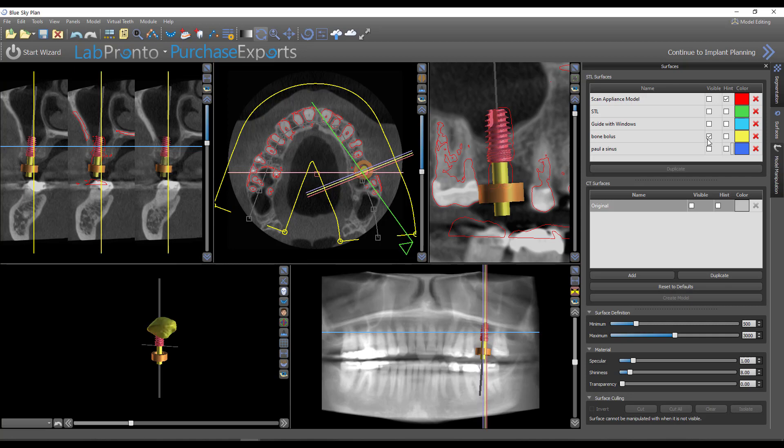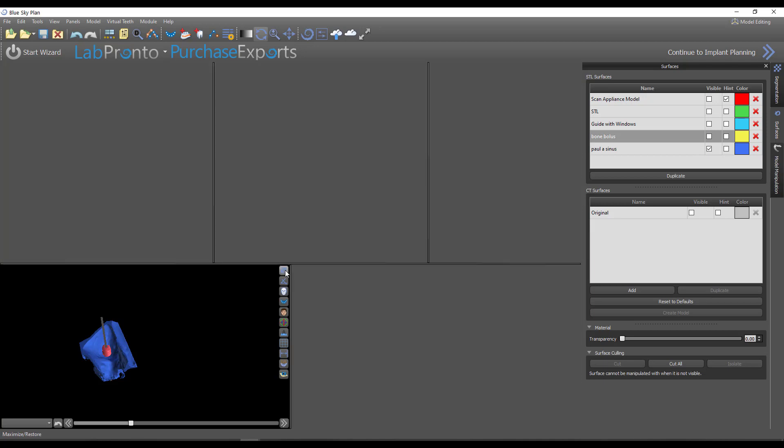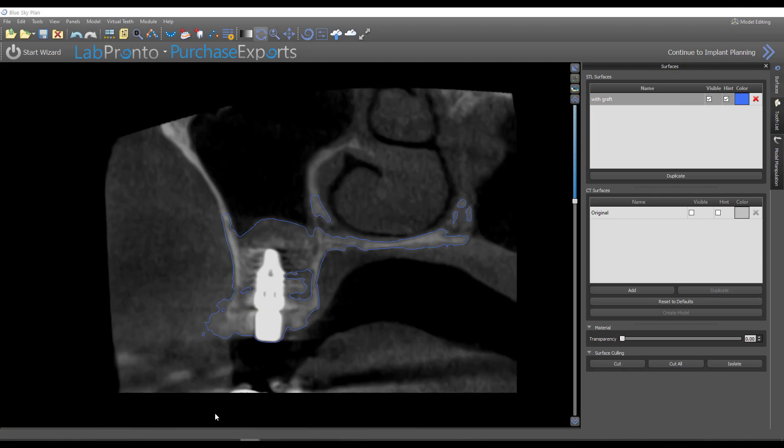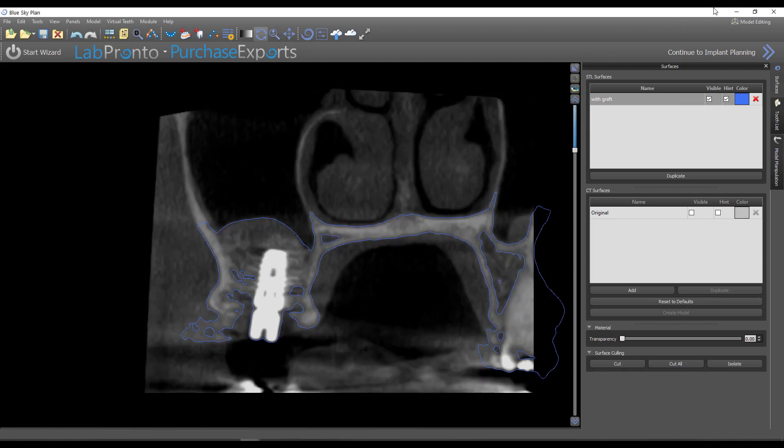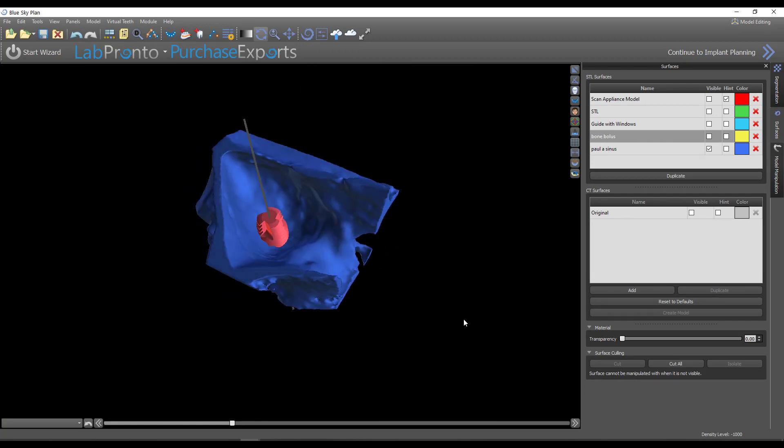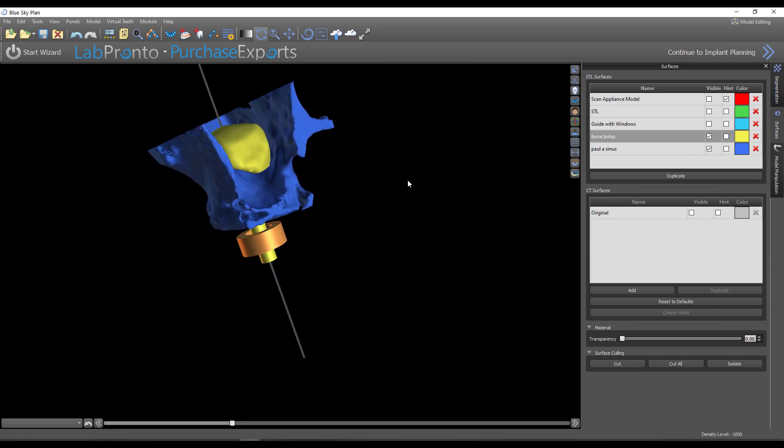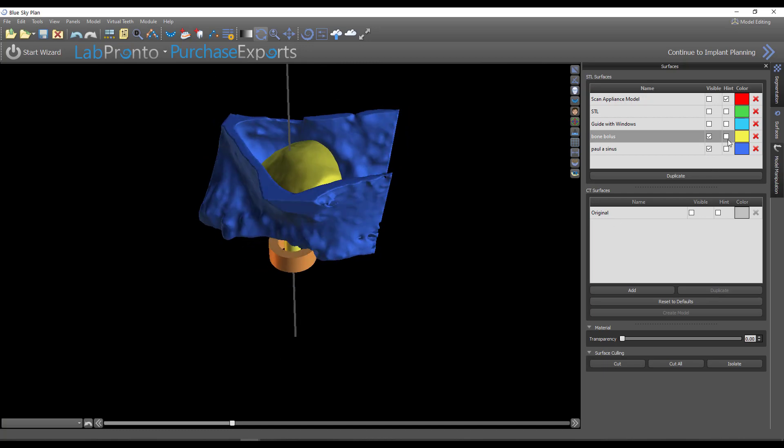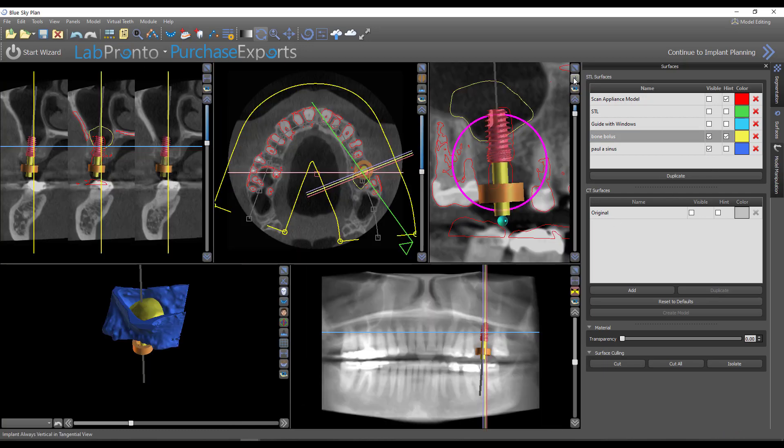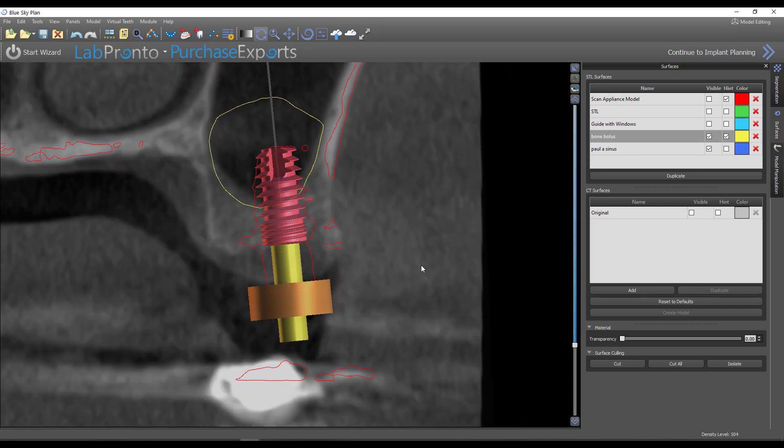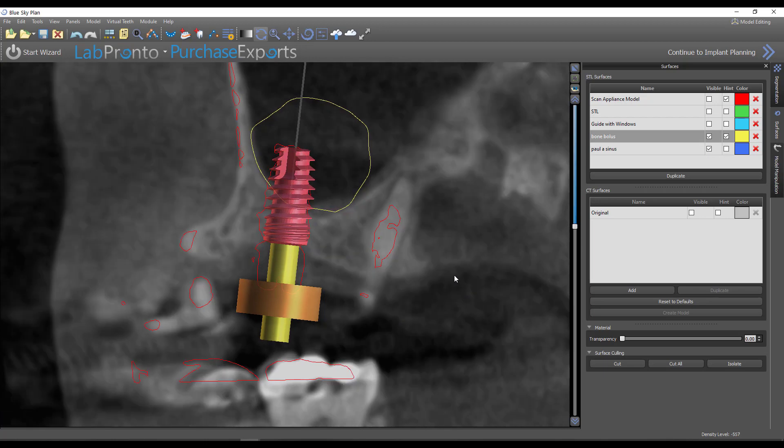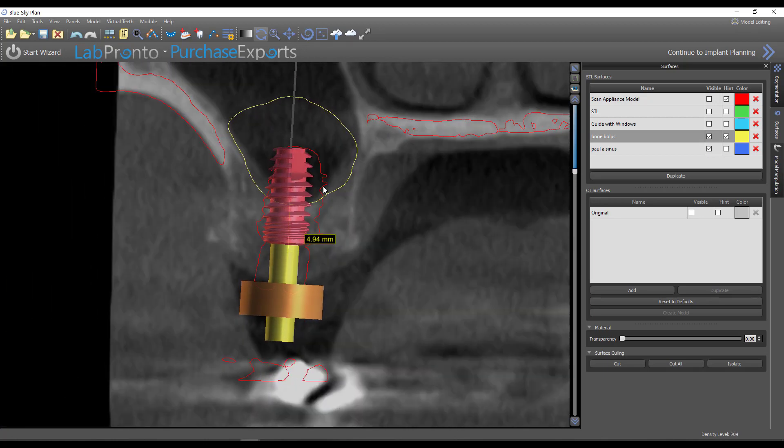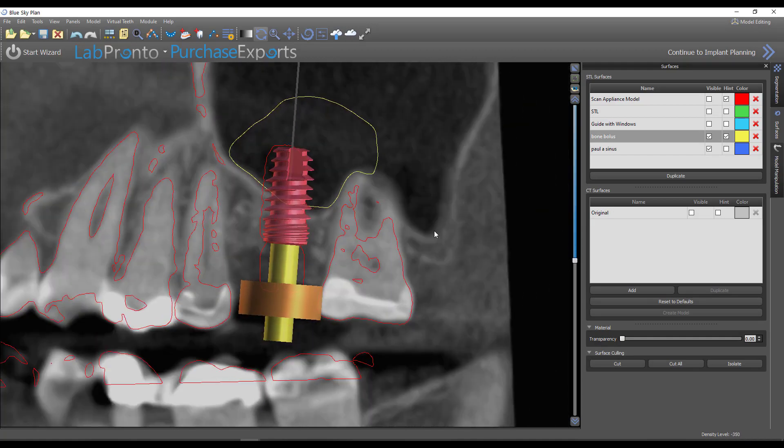Again, if you wanted to go a step further, you could segment out in that other case that I had open. You know, if you jump over here to the one where I've done this, you could just open this as a standalone case and actually segment the bone graft and then import that. And so that's what I've done here and you can actually see the level of the graft that was accomplished. And if I was to go in the 3D windows, you can again, see how large that graft is. So that's about a CC of bone that's in there and that's an incredible lift for a crestal approach. I mean, you could have placed a 14 millimeter implant in there with all the room that was gained. So great kit.